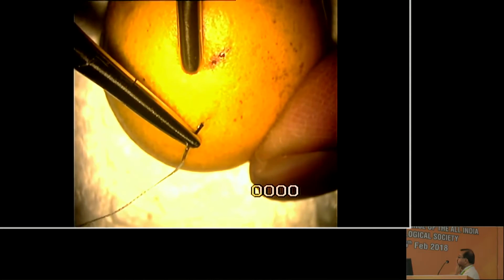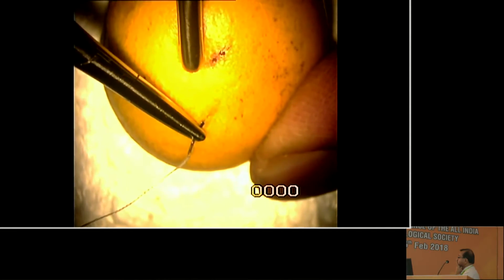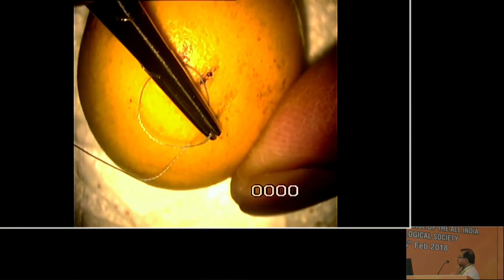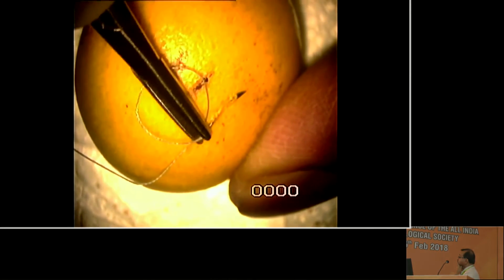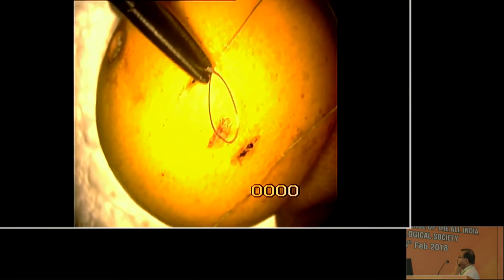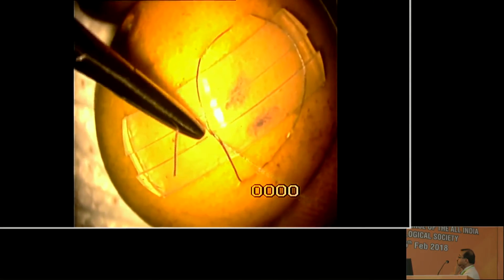Dacron suture remnant bits can be passed through the rind of a yellow lemon to simulate episcleral sutures needed for scleral buckling. Passage of the needle through the rind can be visualized as is needed while passing the needle through the superficial sclera during scleral buckling in a lift and advance technique. This can be a useful prelude to learning scleral buckling surgery.